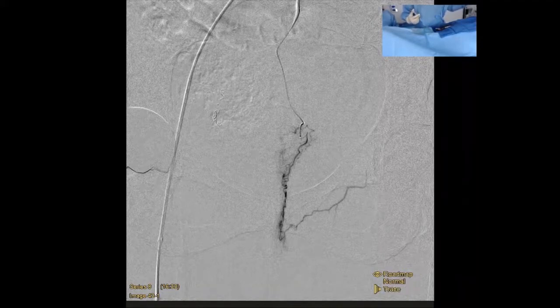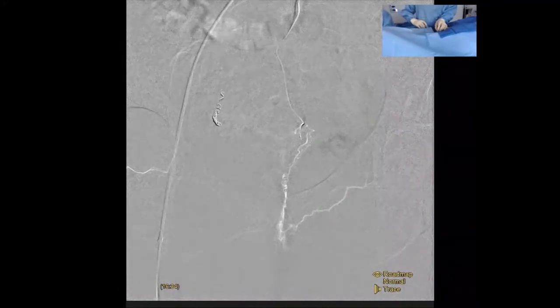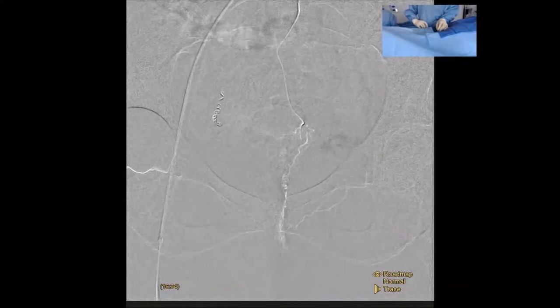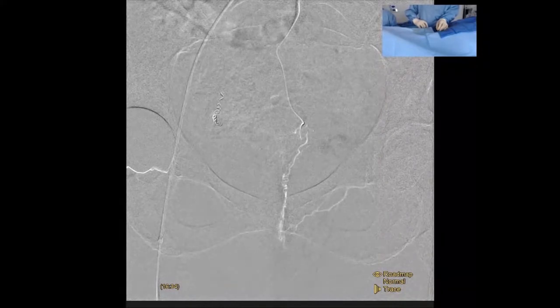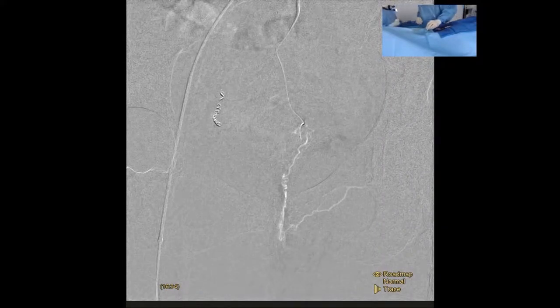It's interesting, from a place where we've done a lot of prostates, we always see these branches, the middle rectal, the inferior rectal, all the time on our runs, and we kind of just think very little of them. Because it's prostate, you don't care about it unless it's in your way and it's going to be an anastomosis. But now these are big players in the Embo. Yeah, you're exactly right. It's funny, these small little channels, right?